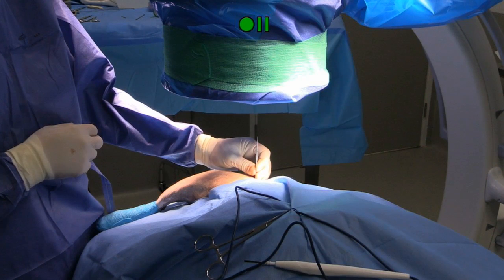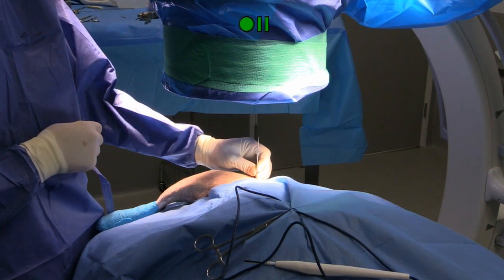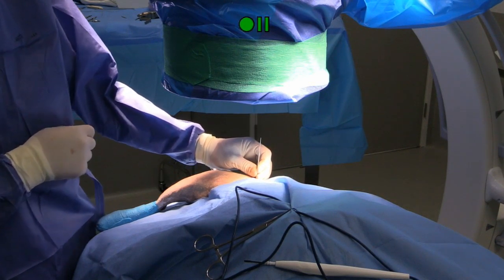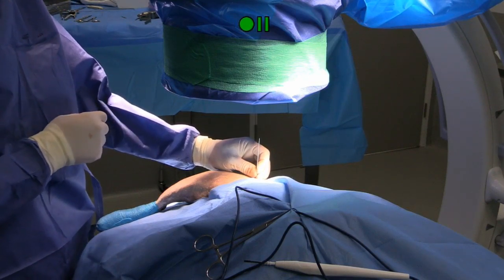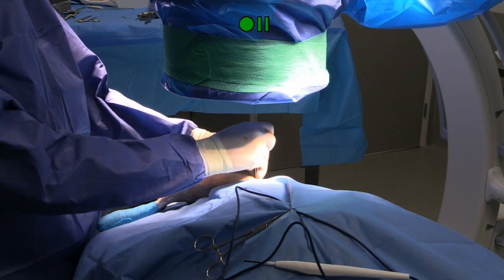You can get radiolucent drills, a right angle drill with a radiolucent head, and you can just drop it down just like that. I've looked for them on eBay, haven't found them at the right price. They sound expensive. Yeah. So we're just waiting for the new functioning drill. Oh yeah, there is one.